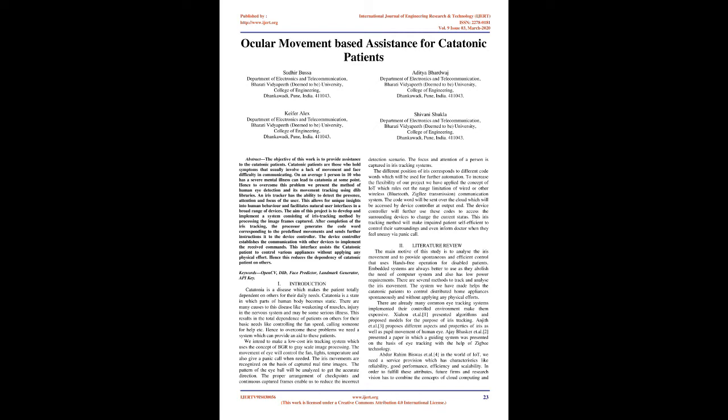This interface assists the catatonic patient to control various appliances without applying any physical effort. Hence, this reduces the dependency of catatonic patients on others. Keywords: OpenCV, dlib, face predictor, landmark generator, API key.